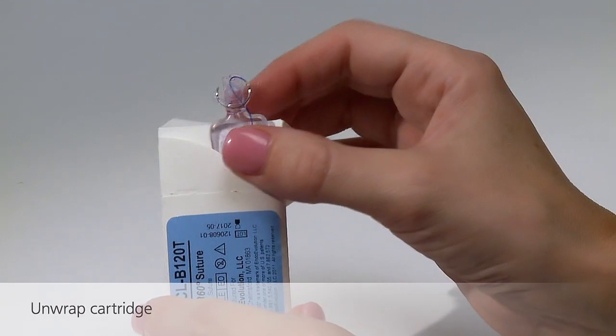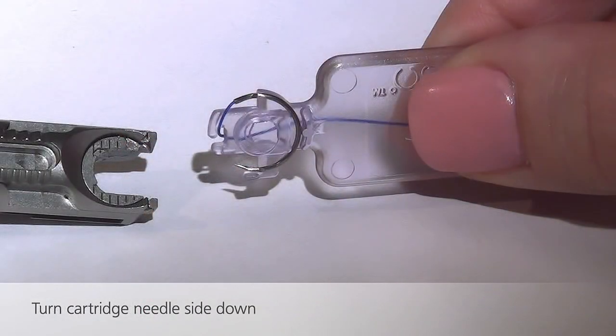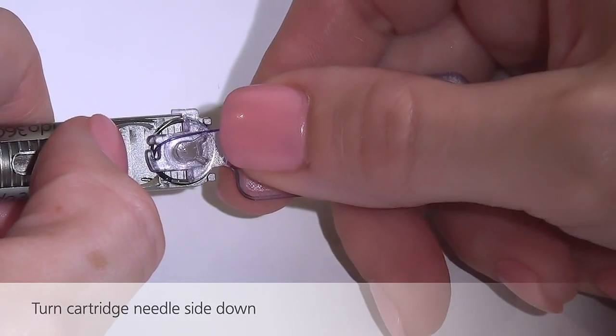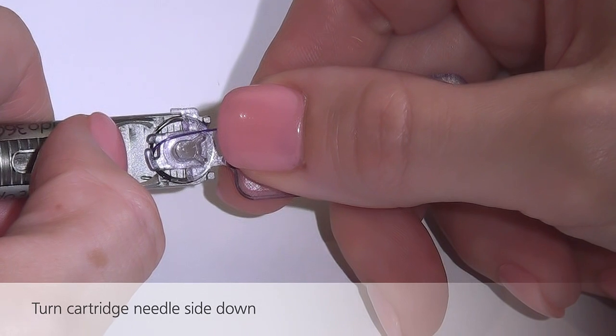Remove the cartridge from the sterile inner package and hold the cartridge firmly between thumb and forefinger. The needle side of the cartridge should be facing down. The thumb should be pressing down on the suture on the back side of the loading cartridge, which should be facing up. Lay the device on a table to ensure stability.